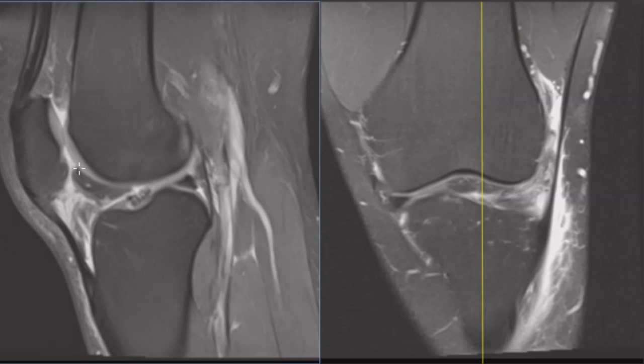But he does have something abnormal here in front. There's an area beneath the kneecap. Here's the kneecap, and there's a fatty area here called Hoffa's fat pad, and this should be very low in signal and uniform. So, for example, up here, this is the prefemoral fat pad. Fat, see how uniform it looks, just homogeneous. It'll look just like fat back here, or fat in the front. But down here, the fat is not homogeneous and dark, it's bright.